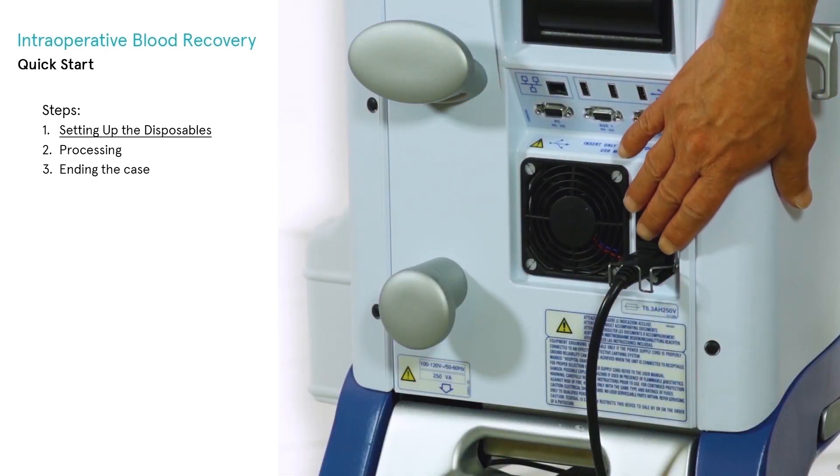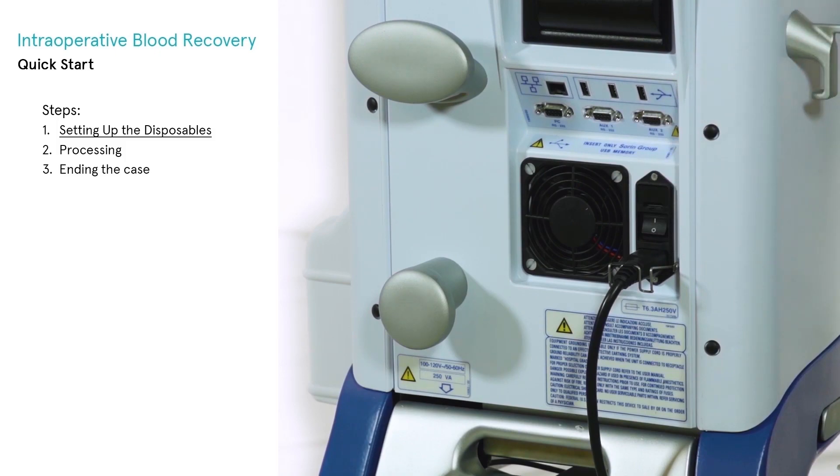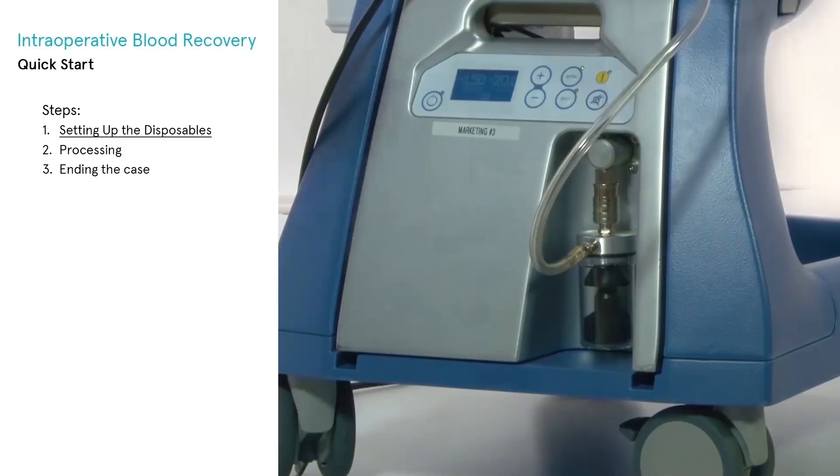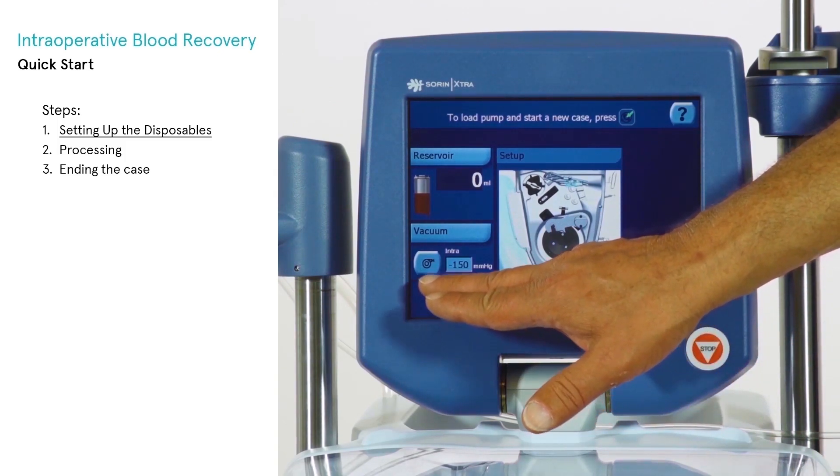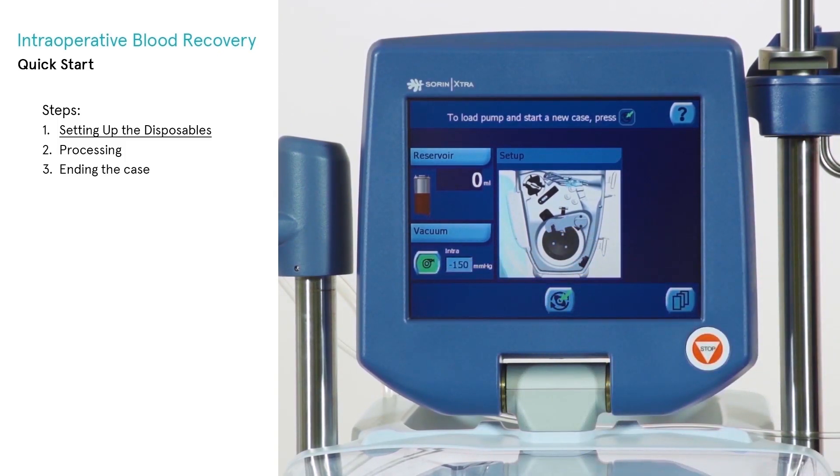Power on the Extra using the power switch on the back of the unit. As soon as the display on the X-VAC lights up, you may power up the X-VAC using the power switch on the X-VAC module. Once the Extra is fully booted, if the vacuum has not been powered on from the module, touch the vacuum button on the touchscreen interface to activate it.